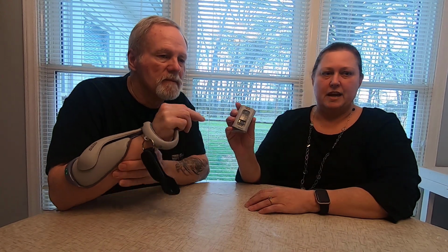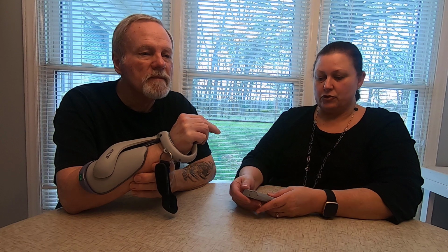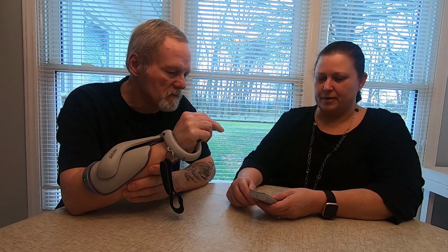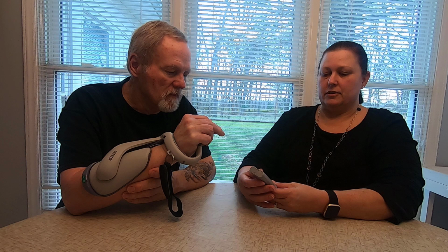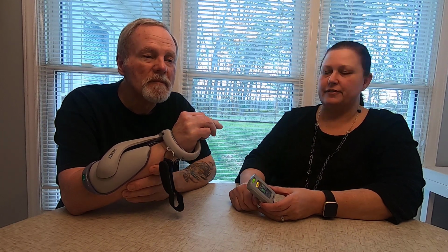And then we have this device that it came with. This is the remote control for it. So when we turn this remote control on, you have to wait for it to sync up and connect. And then I will start it, and you'll see his hand. See how his hand is starting to move?